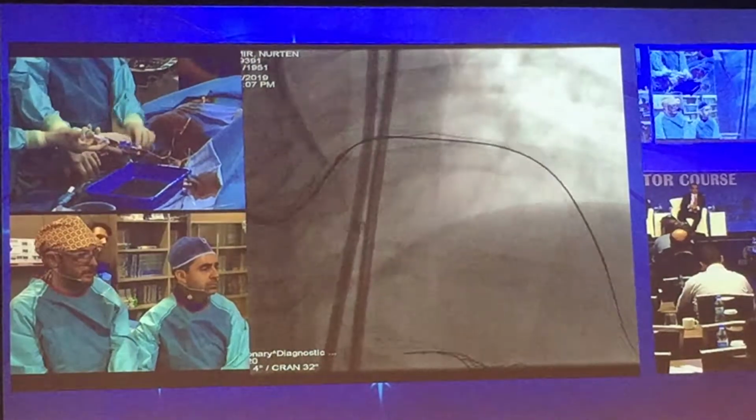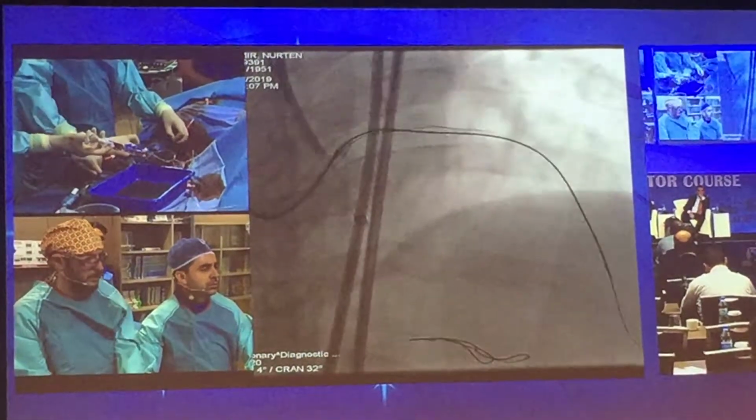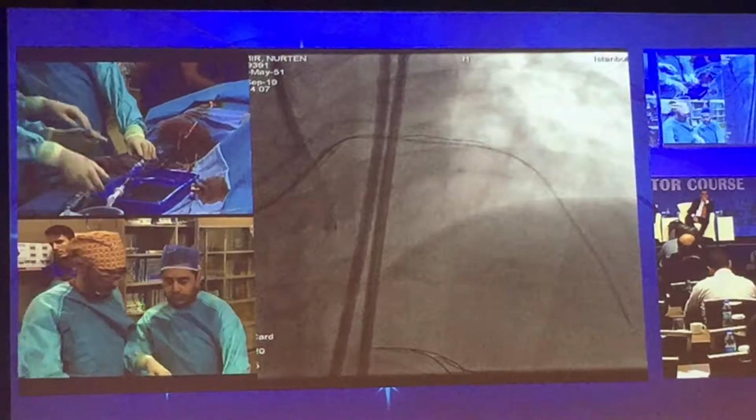They are somewhere moving. Şevket, you are in the lab, I think. Yeah. Okay, tell us. Contrast.